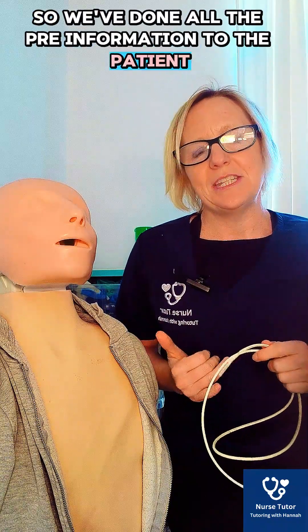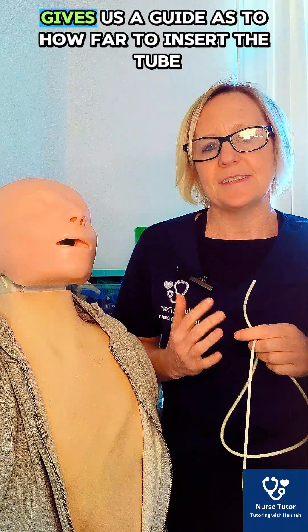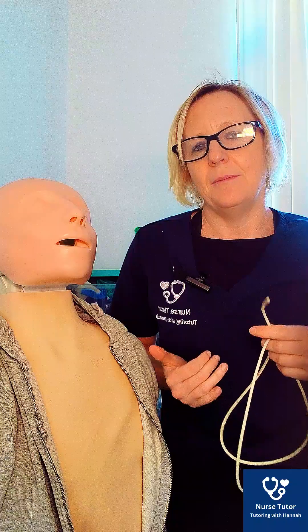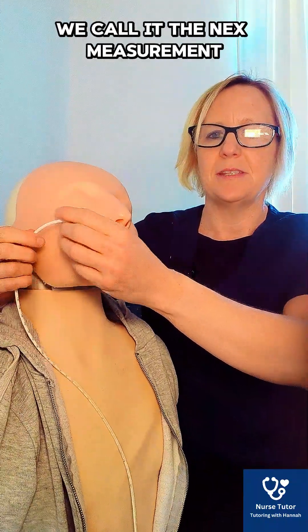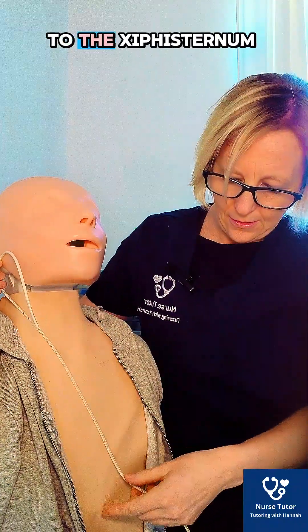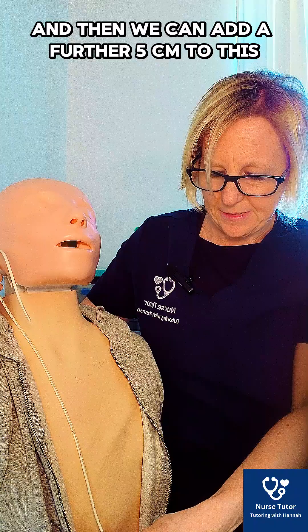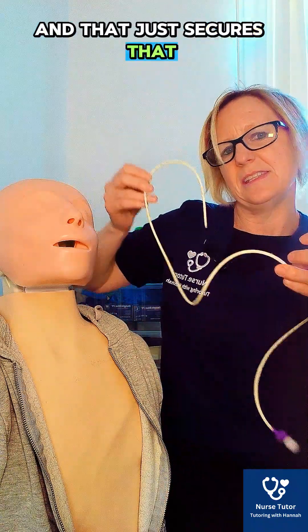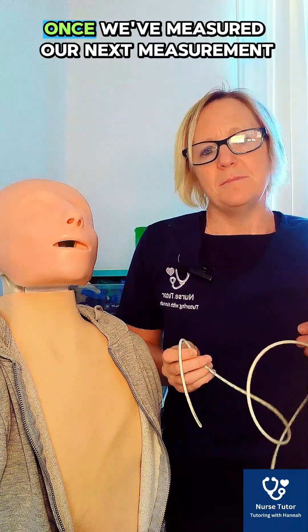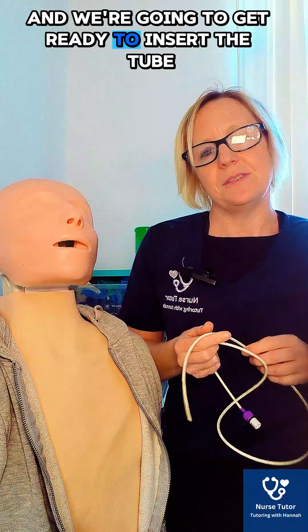We've done all the pre-information to the patient and gathered all our equipment, so now we're going to do the NEX measurement. The NEX measurement gives us a guide as to how far to insert the tube to ensure it is anatomically in the stomach. We measure from the nose to the earlobe, then from the earlobe down to the xiphisternum — the bottom of the sternum — and then add a further 5 centimetres to ensure it's below the diaphragm, minimising the risk of incorrect positioning. Once we've measured, we lubricate the tube in warm water for 15 to 20 centimetres.